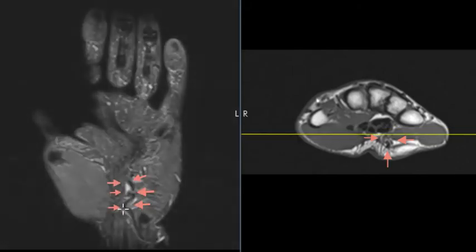So when you see a blood vessel that's tortuous in here, this may be the ulnar artery. It could be tortuous, could have an aneurysm, or just be occluded. If we see that and have the right clinical symptoms, we call it hypothenar hammer syndrome.